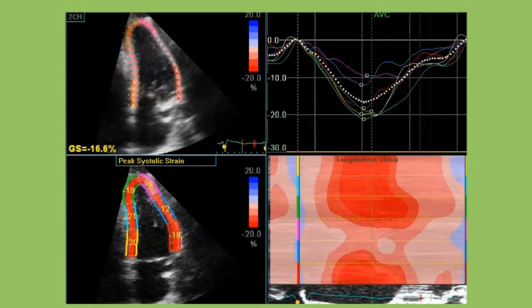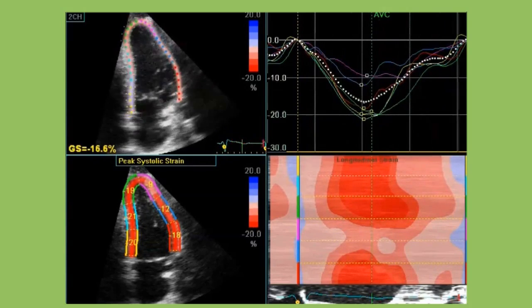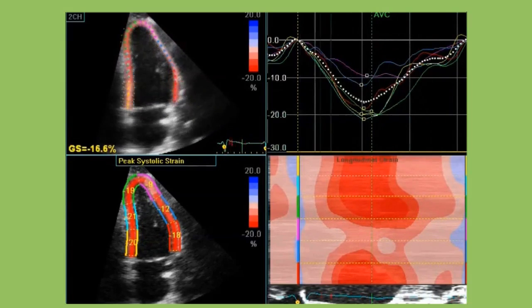So, as you can see, this case was from 2008. I was at MD Anderson at that time. This was the first case where we used strain imaging for the interrogation of a patient. And as you remember from the initial presentation, it's a fairly young patient.